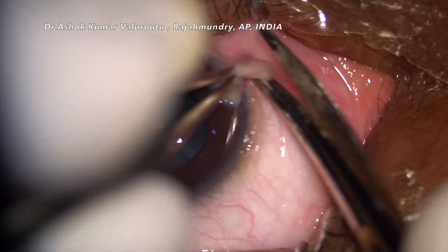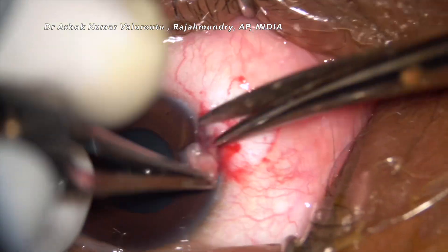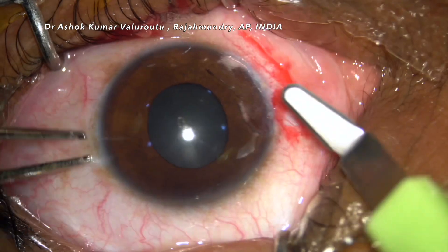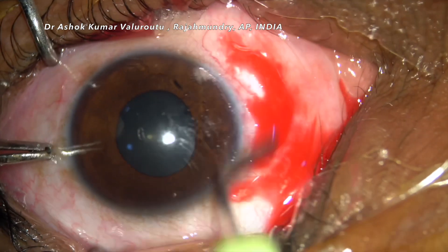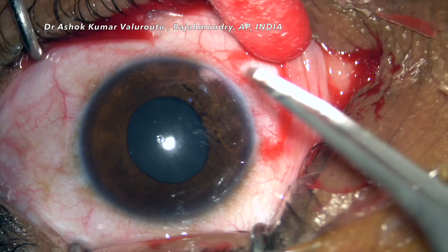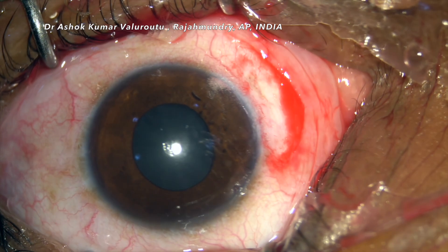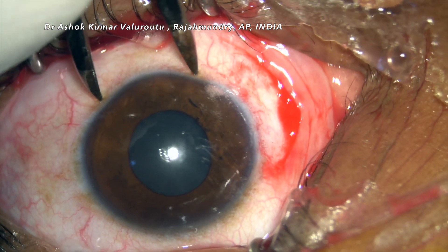Hello friends, this is Dr. Shogh Kumar. Today we are seeing a case of nasal pterygium excision with conjunctival autograft. Going to the basics, the main cause of pterygium is the lack of limbal stem cells. If these limbal stem cells are active and present in sufficient quantity, they prevent the occurrence of pterygium. In autograft, we are actually transplanting the limbal stem cells from a healthy limbus area.